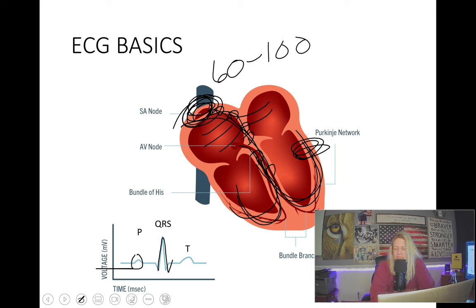Okay, I have these weird things in the middle. This is the QRS right here, and this is the T down here. Then I have a QRS and a T, and then a QRS and a T. There's no P wave, which means these aren't sinus beats. These are something else, right?